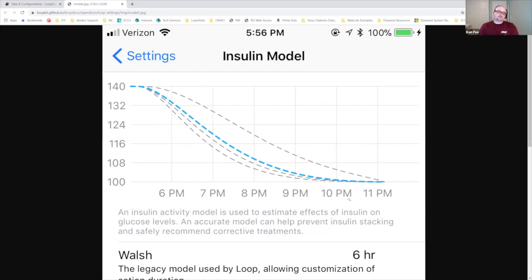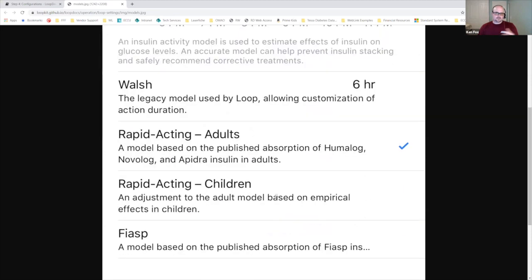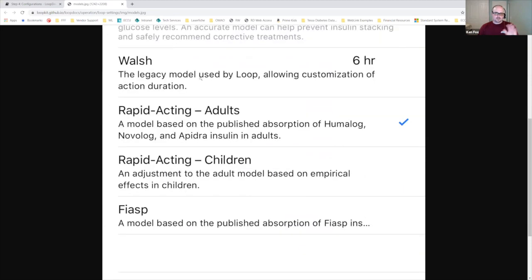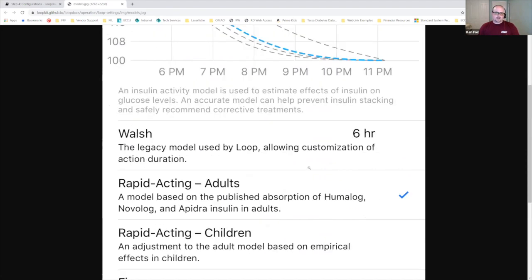When you tap on the glucose graph — the top graph from the main Loop screen — this is where you end up. The top one is Walsh, then you have Adult, Child, and Fiasp. Don't use Walsh. Rapid Acting Adult, Children, and Fiasp are fine — they're a good place to start.